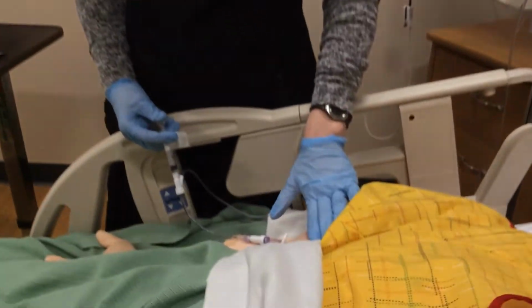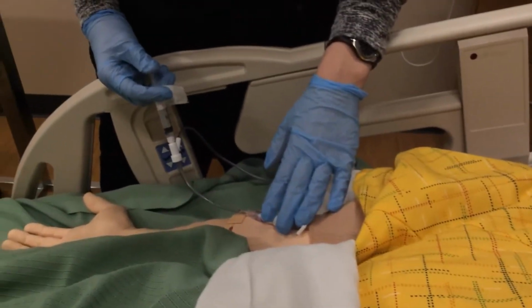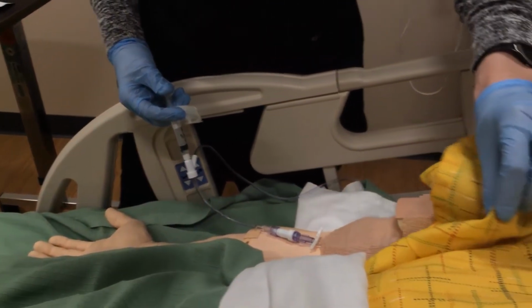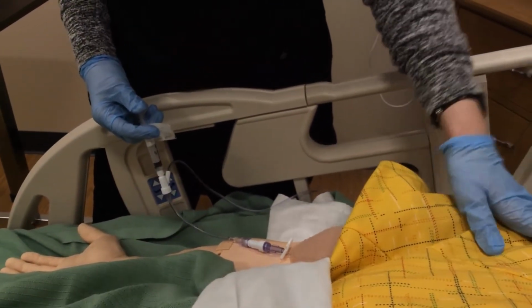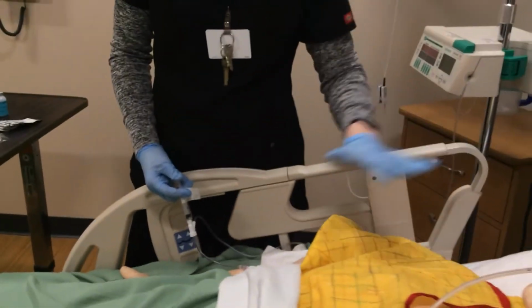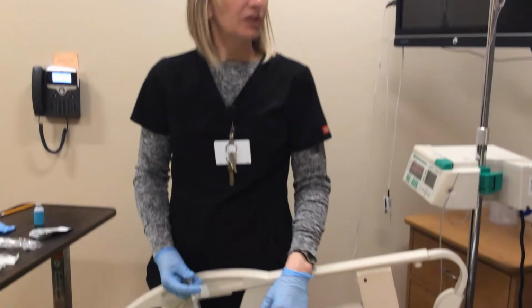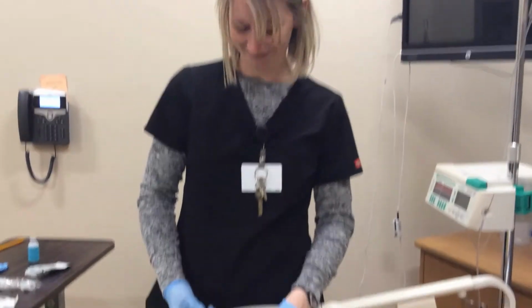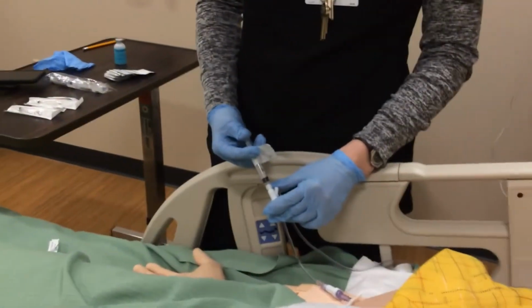So as well as I'm pushing this medication, Colin, are you having any pain or anything at the site, any stinging? He tells me no. I said, okay, that's great. If at any point, though, you feel any pain or stinging or swelling that you can tell is going on, please let me know, because that could be a sign that your IV site is bad, so I'd want to come and assess it right away, okay? He's like, okay.